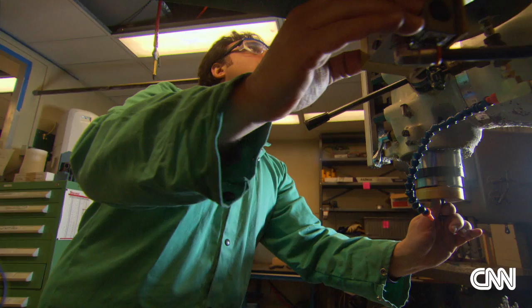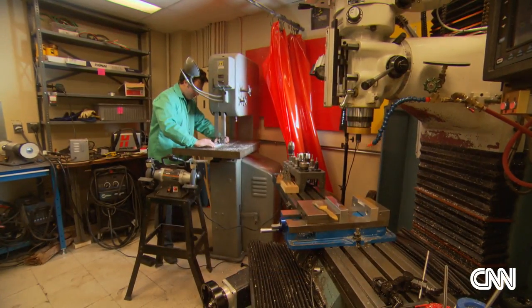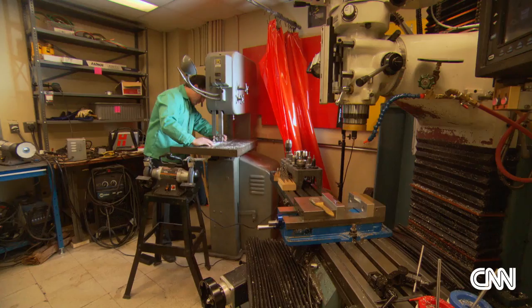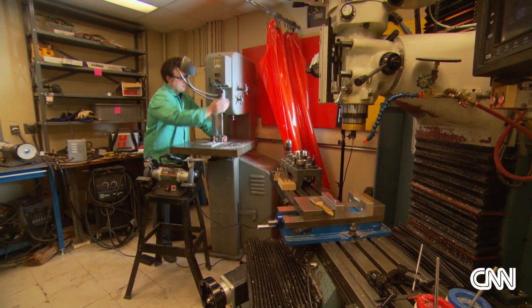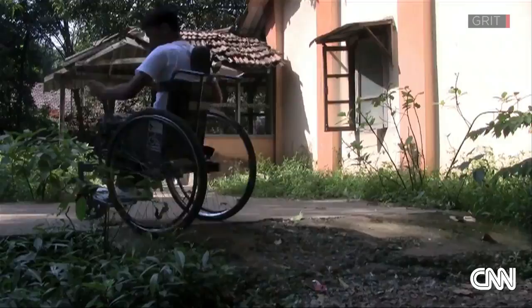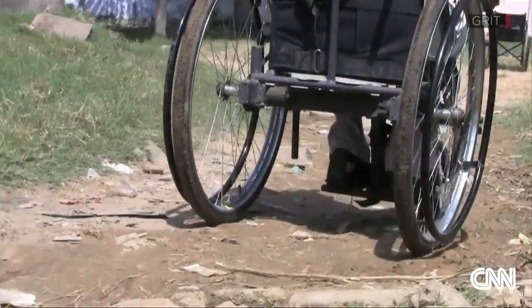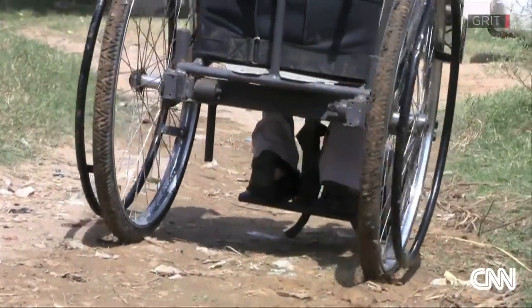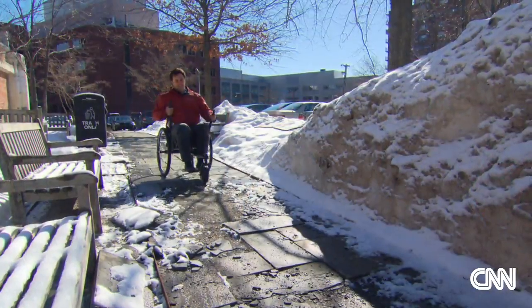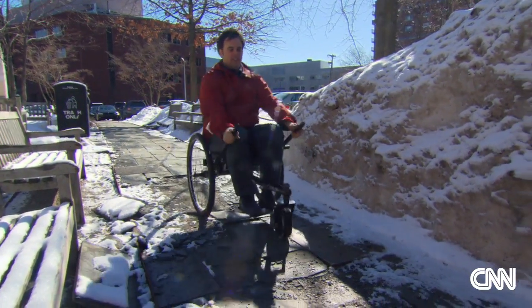Dr. Winter's world is one of machines, raw materials, and complicated ideas made concrete. The Leverage Freedom Chair, he suggests, is just the beginning. You have billions of people that face challenges that are often life or death in nature. They have a technical aspect to them, and nobody knows how to solve those challenges. What better foundation for research could you ask for? In Cambridge, Massachusetts, Jim Morelli for CNN.